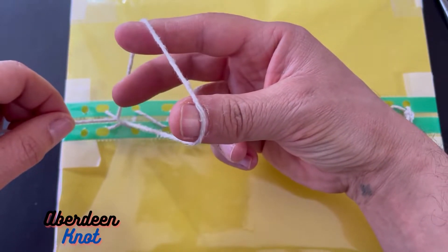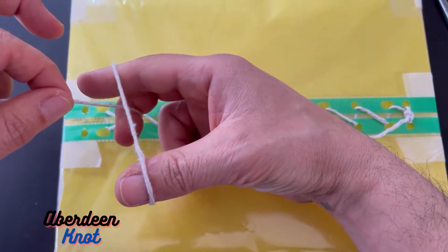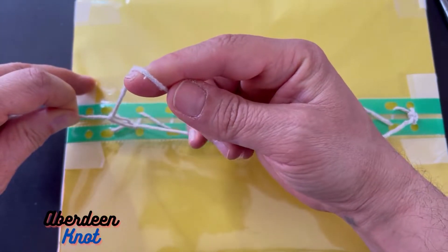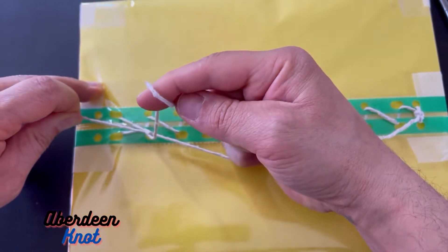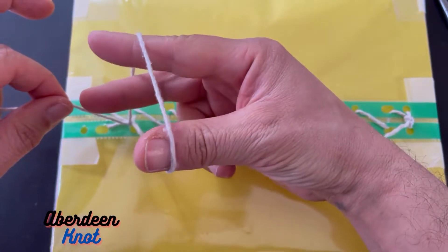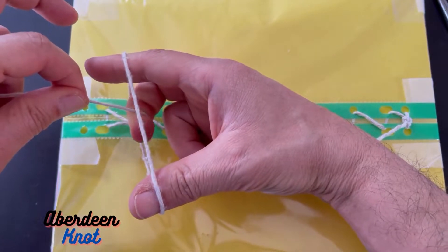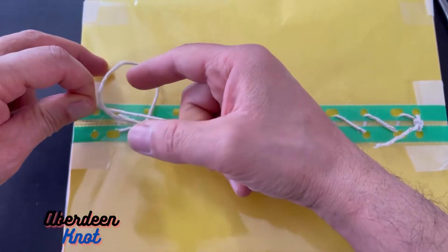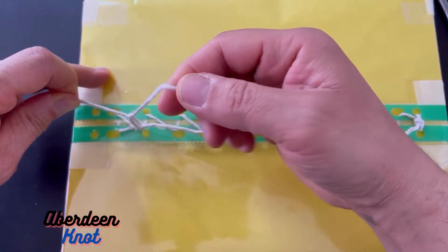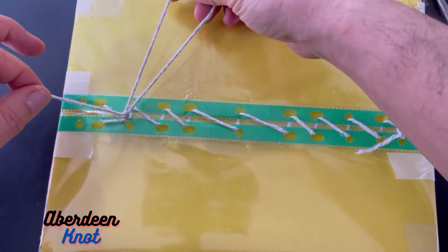Against three fingers — same three fingers: thumb, index, and middle finger — and again pull this end back. The left hand doesn't move at all. Keep pulling from the lower part, pulling until it's a tight loop. Then again thumb and index finger hold the triangle, middle finger goes in, and keep pulling from the upper part while the other end is still held. Keep pulling until the knot is formed.